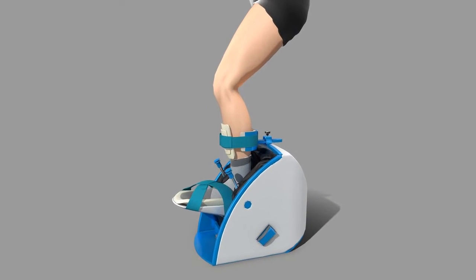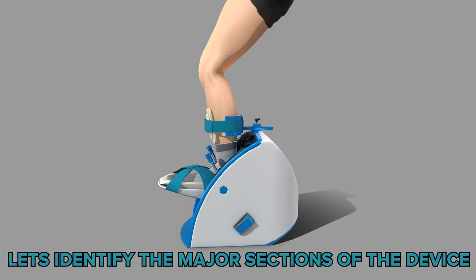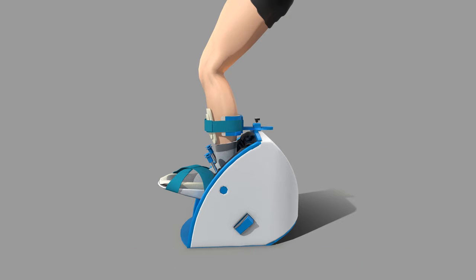Now that you know what the foot device looks like when properly equipped, let's break down the major parts that compose the foot device. This will help to prevent confusion as we go through putting the device on step by step. This is the footbed. This is the chassis. This is the calf cuff.